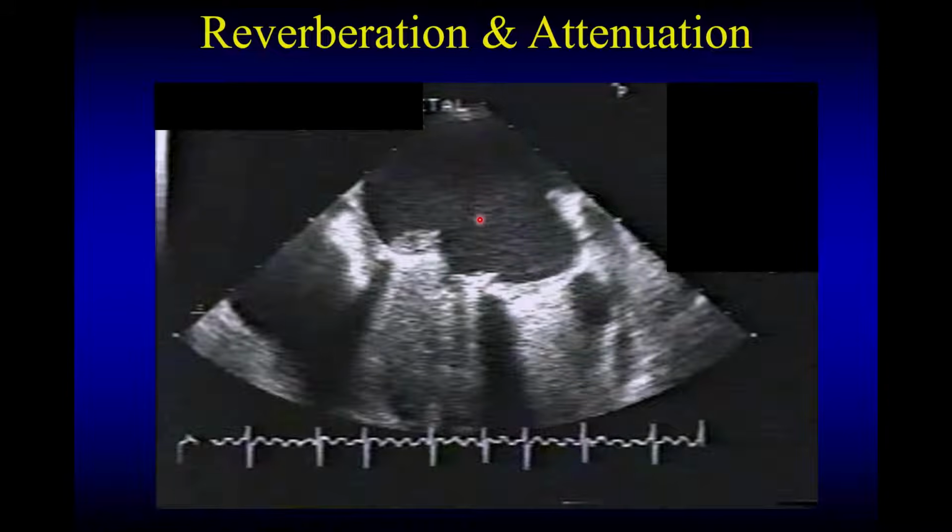The ultrasound comes in, most of it is reflected back, very little traverses beyond it, so you're not going to be able to see beyond it, and what you're going to see is mostly blackness or shadow, meaning that I'm not able to penetrate even further beyond this, either calcium or mechanical property or any other properties that would inhibit further propagation of the ultrasound beam, as opposed to where you have fluid, like blood here. It traverses very nicely, unhindered, all the way till it hits a certain structure.